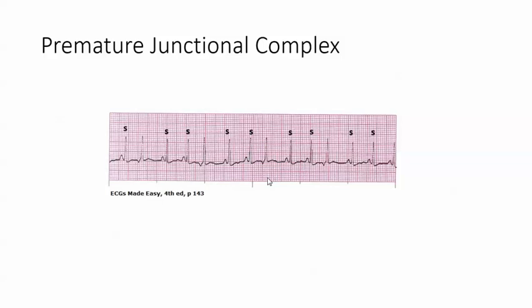So the next thing we're going to do is look at the ones that are not normal. Look at that — that's an inverted wave. Let's call that a J. So junctional rhythms — their P waves — three things can happen: you won't see them at all, they'll be inverted, or they'll occur after the QRS. So there's an inverted one, there's an inverted one, here's one, there.